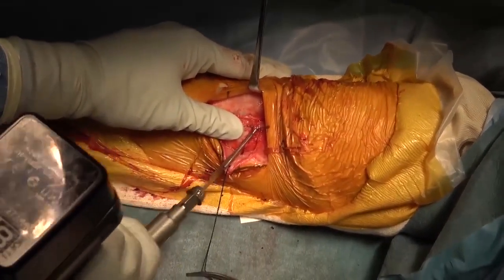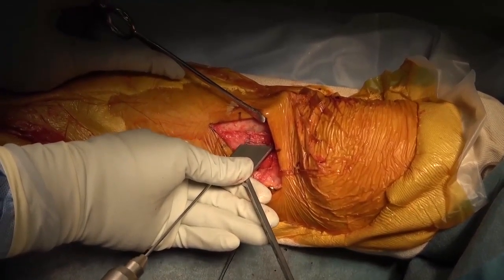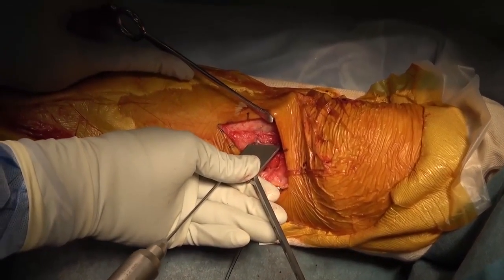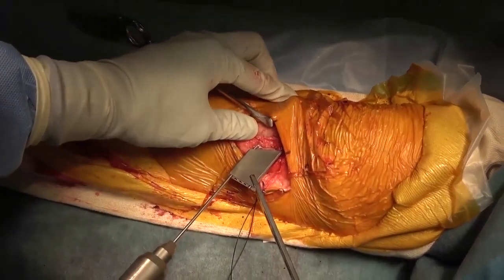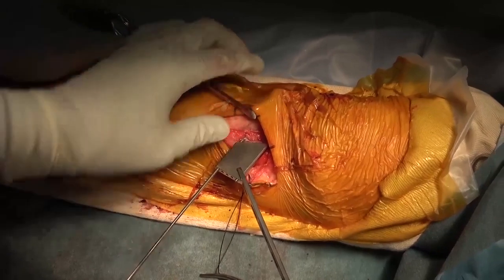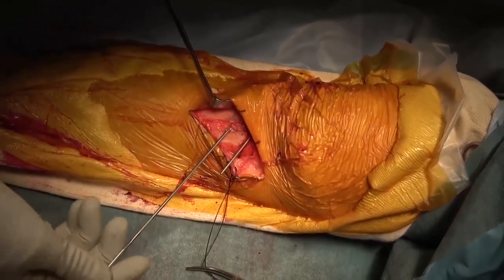second guide wire. A third 2 mm K-wire, parallel to the second wire, is inserted at a distance of 15 mm distally from the second wire. These 2 guide wires serve as a reference plane for the descending osteotomy.